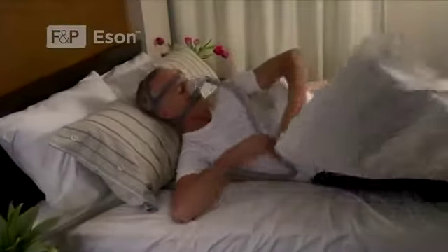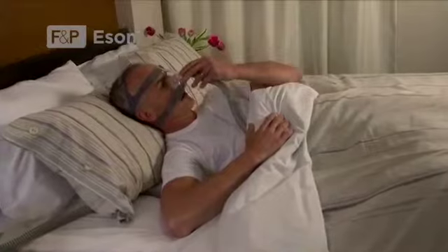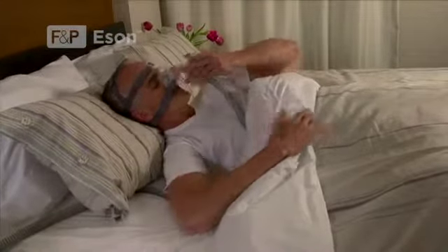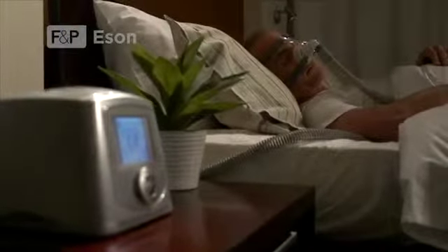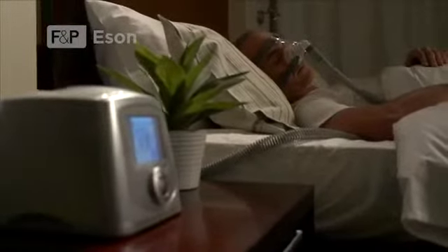You have received a nasal mask for delivery of positive pressure therapy through the nose. The F&P ESON nasal mask delivers pressure therapy directly to your nose. It is designed to perform in tune with you and your needs.